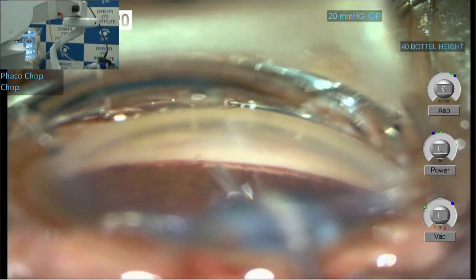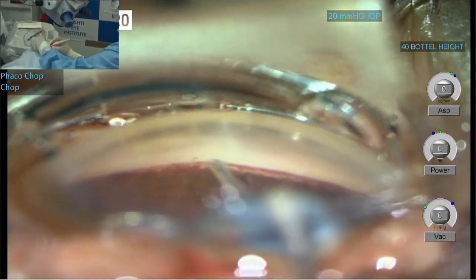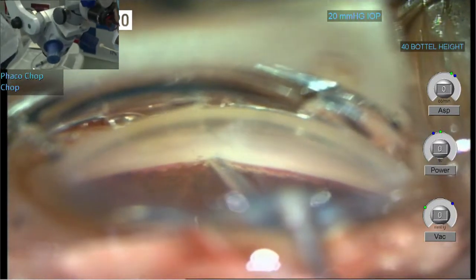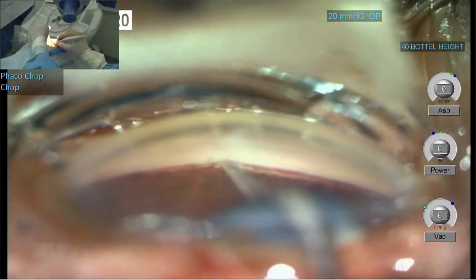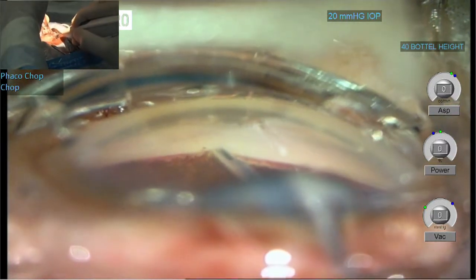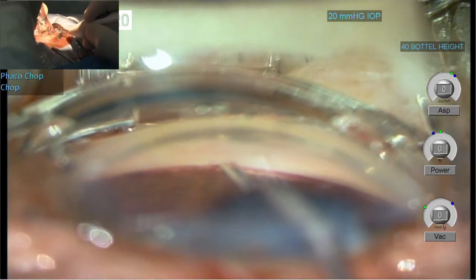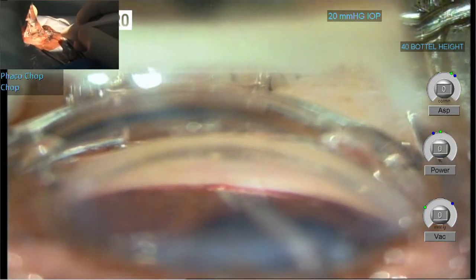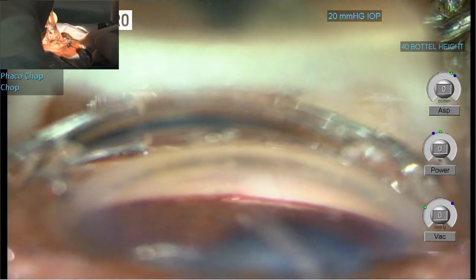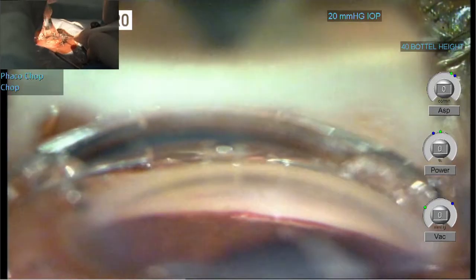So what I'm supposed to do is go perpendicularly so that this trocar hits the trabecular meshwork perpendicularly. I'm dimpling right now and then releasing a little and then shooting and very slowly withdrawing. So blood reflux is a good sign. So you can see, is everyone able to see that titanium inject which is right there?